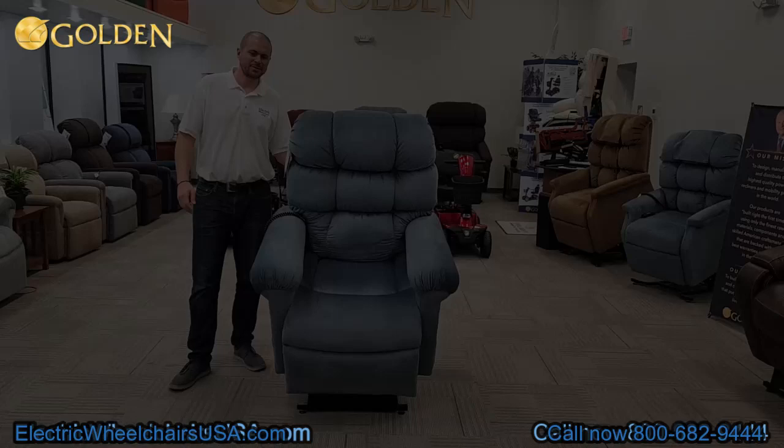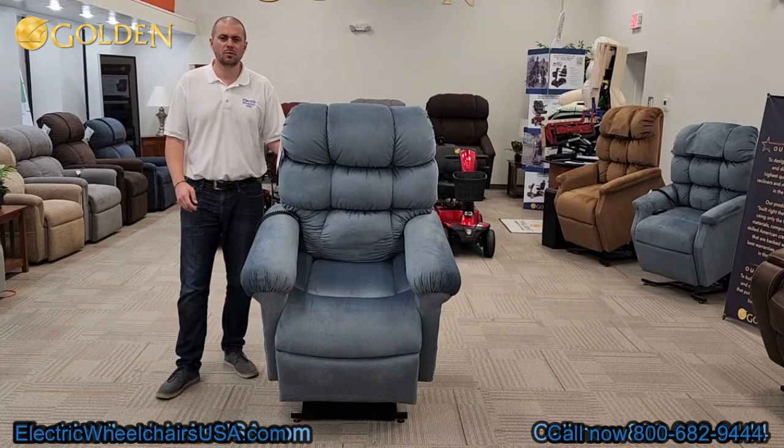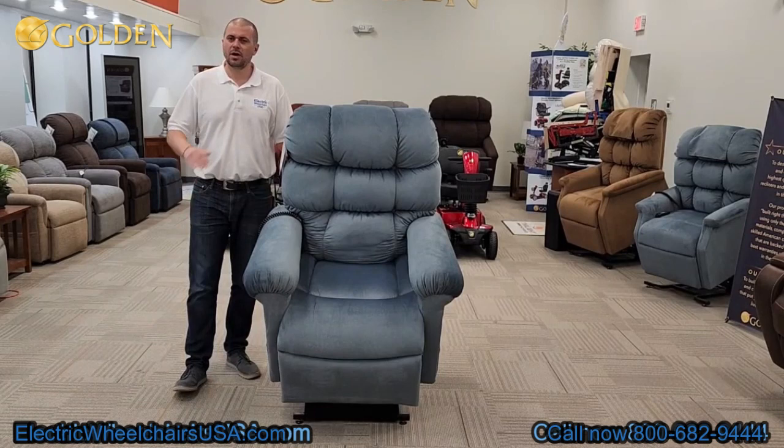If you're looking for an awesome lift chair that's unique to the industry, manufactured in Old Forge, Pennsylvania, here in the USA, this is a great choice. Golden Technologies is one of the best brands in the industry, with one of the best warranties — including one year of in-home service. As long as you have a warranty-approved claim, they'll send a technician to your home to diagnose and resolve the issue. If you have any questions, call us at 1-800-682-9444 or visit electricwheelchairsusa.com.